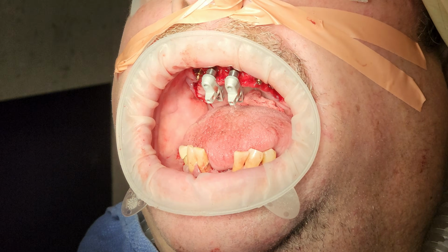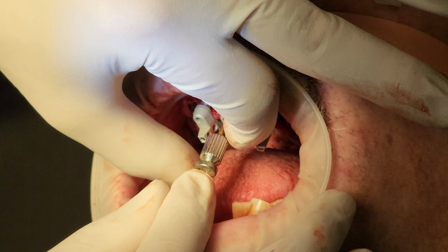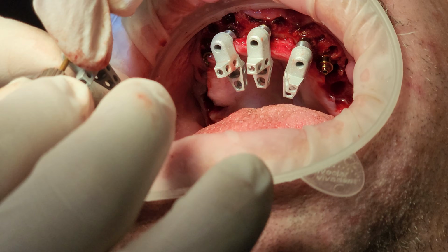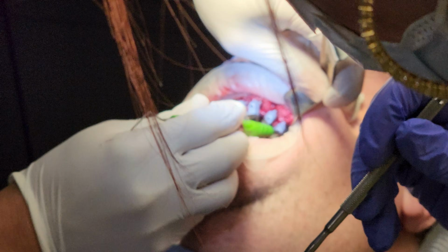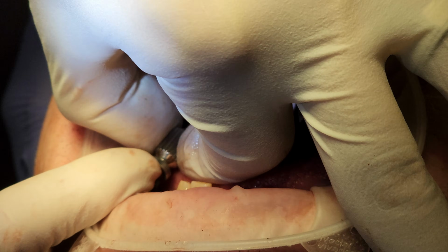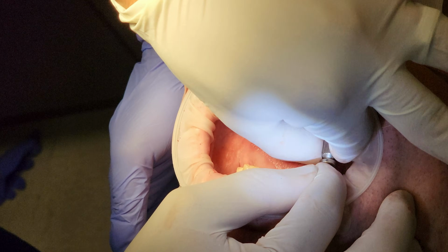To do it, we screw in the base pieces of the jig into each of the MU abutments. Then we cut down and approximate that mesh to the attached pieces. Also, with the implants covered, but before we attach the mesh, we put bone graft in everywhere there's a socket left behind. This graft reduces the amount of bone collapsing as everything heals. Then we attach the mesh to the base pieces by injecting dual cure resin into the base as it flows along the mesh.